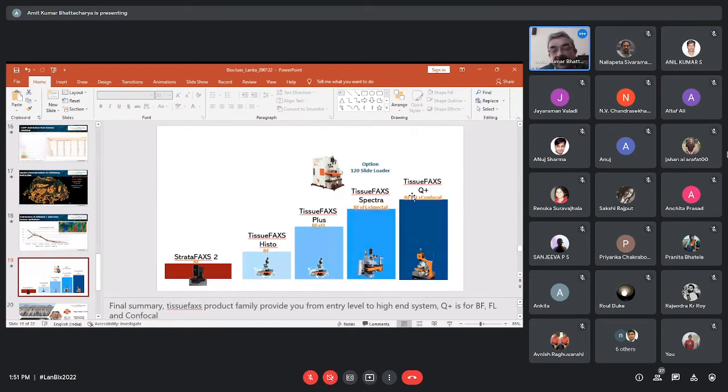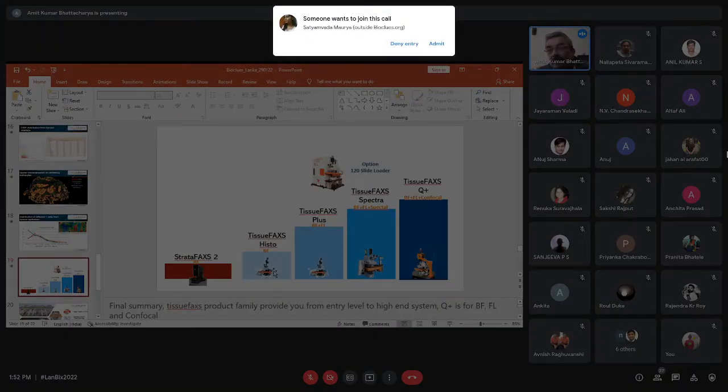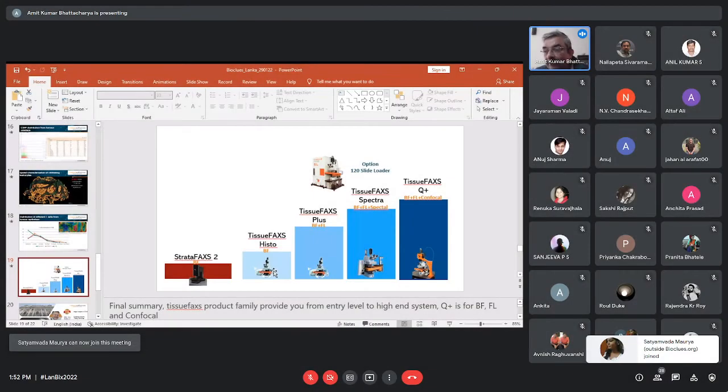So I gave you an idea of the possibilities of image analysis. A little note towards the end on the kinds of hardware that are possible. You can begin with a very basic hardware which will only acquire data from chromogen stained images, not fluorescent. And the hardware complexity goes up depending on how much data, and how rich, detailed data you want.